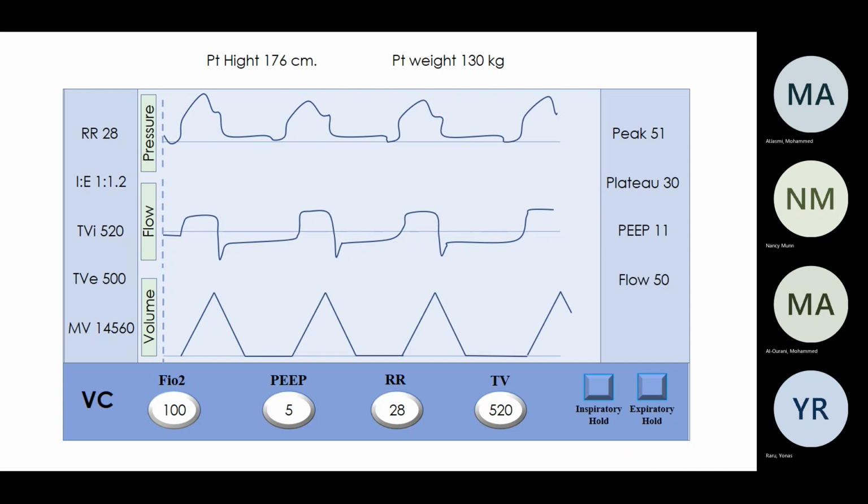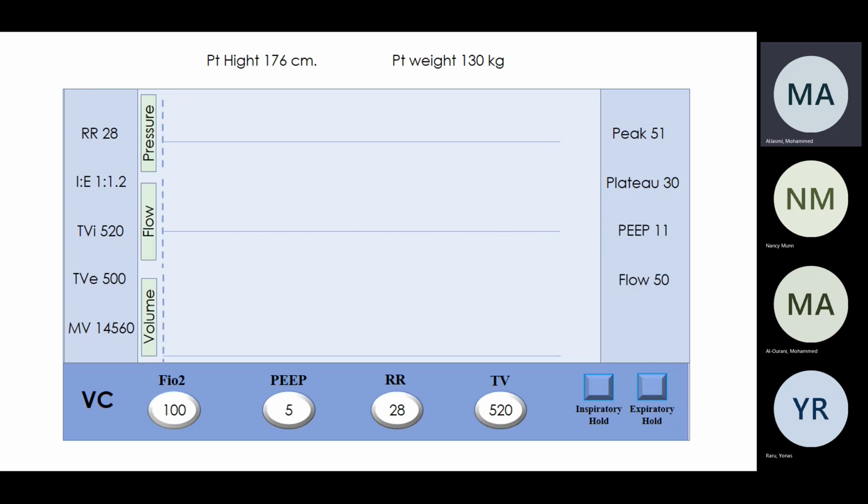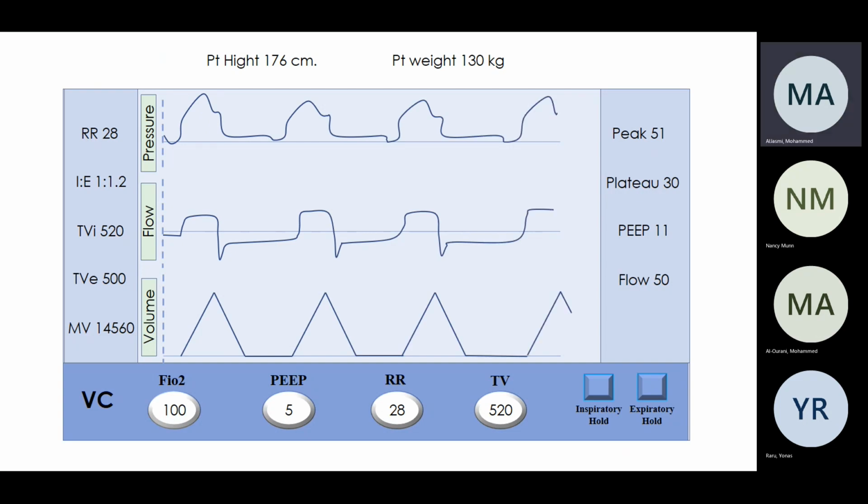Acceleration. Okay. All right. What do you think about this patient now? So now you have plateau, Ramsha. Peak is 51, plateau is 30. What's his resistance? Let's make it quick, guys. We don't have Rami, unfortunately, so we need to use calculators.